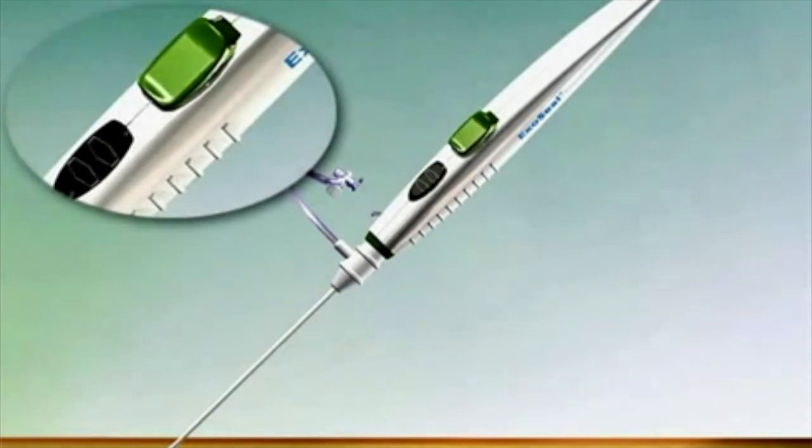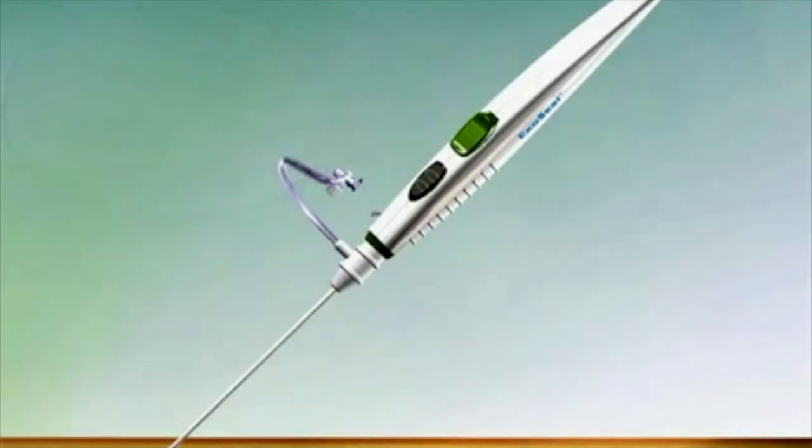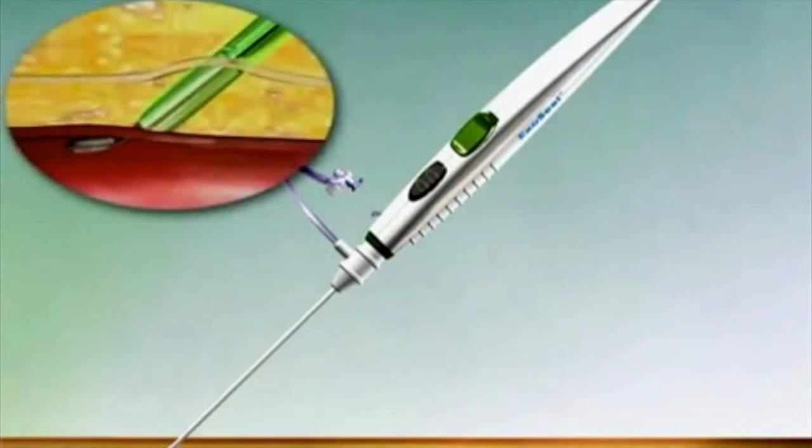Fully depress the plug deployment button to deploy the plug. The indicator wire will automatically withdraw followed by deployment of the plug at the vascular margin.